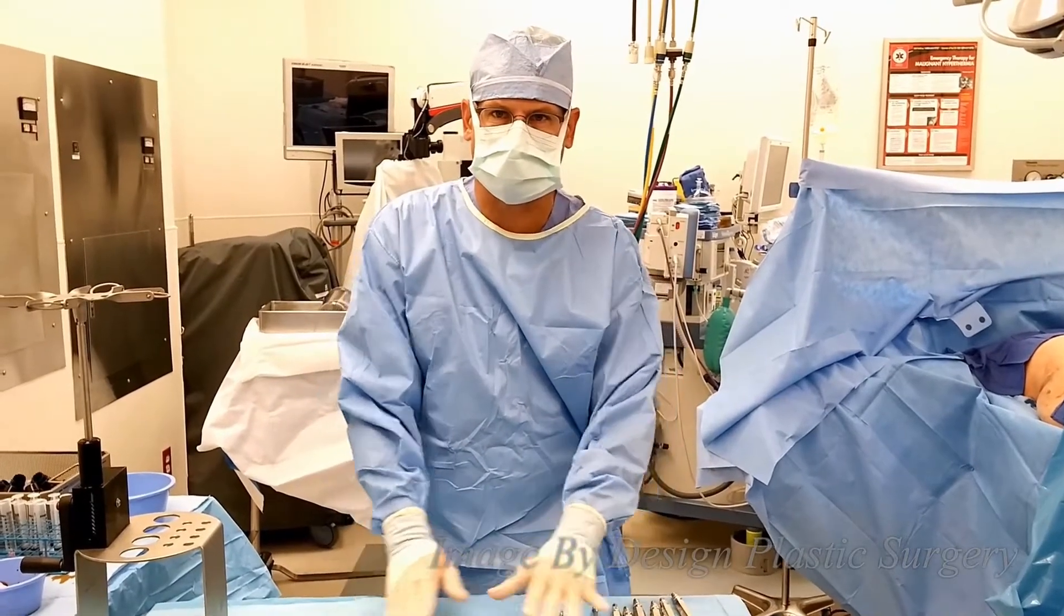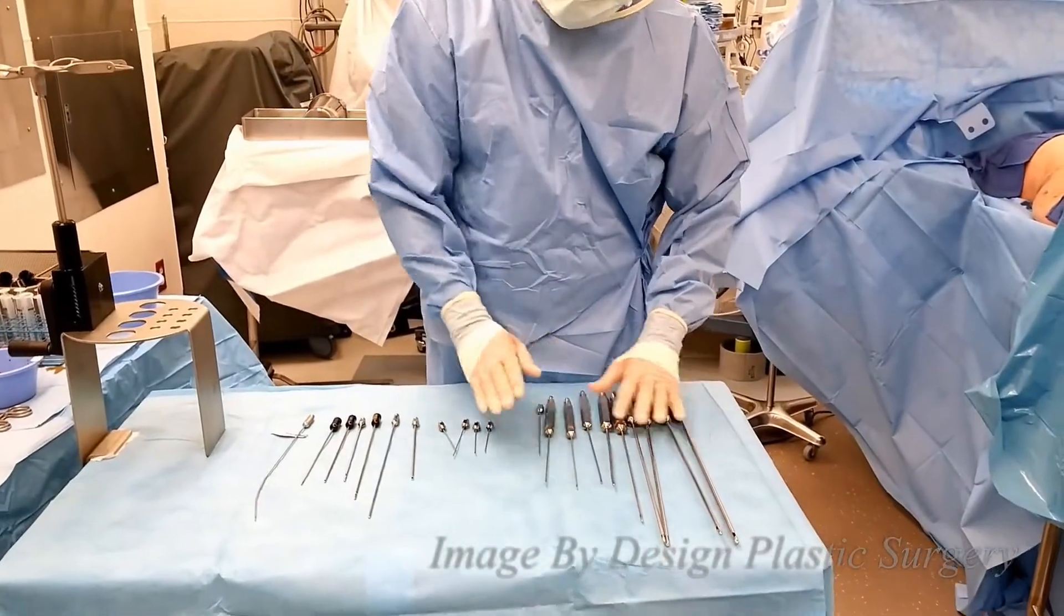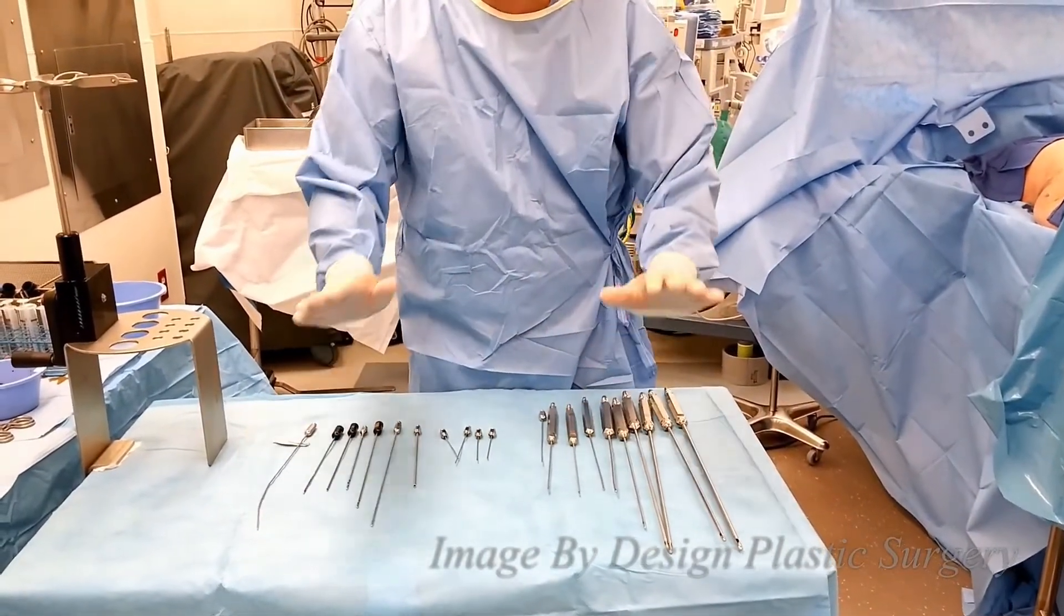I'm going to show you some basics about how the cannulas work. So come down here if you would, and we're going to look at the different sizes of metal cannulas.